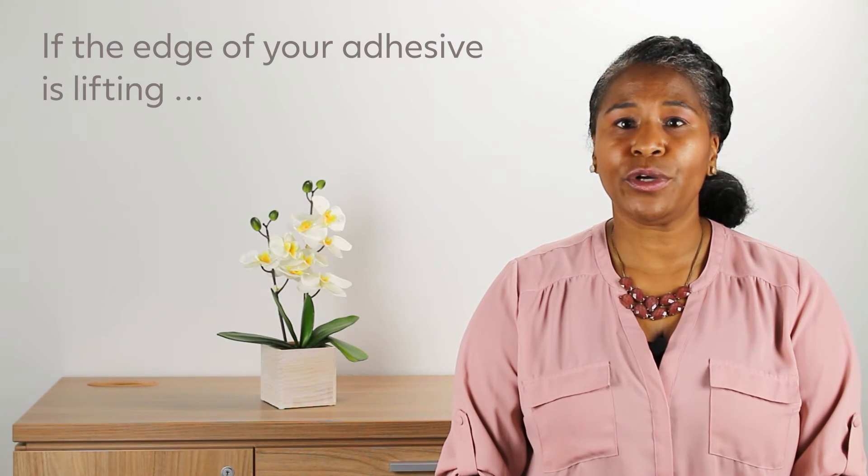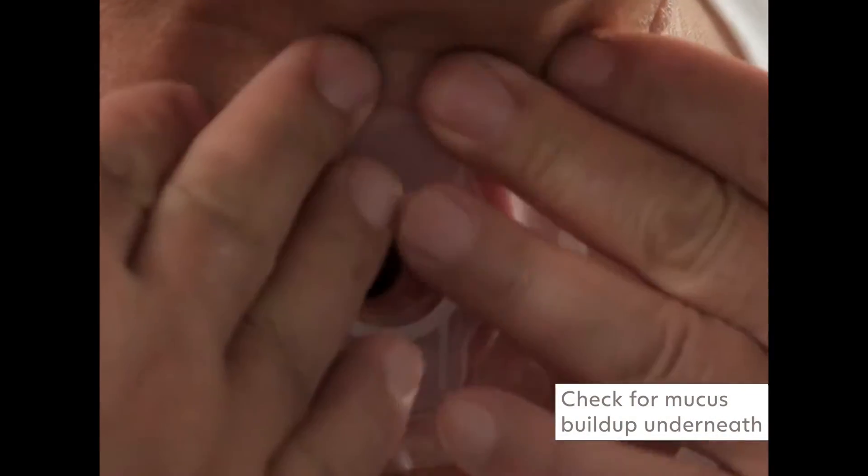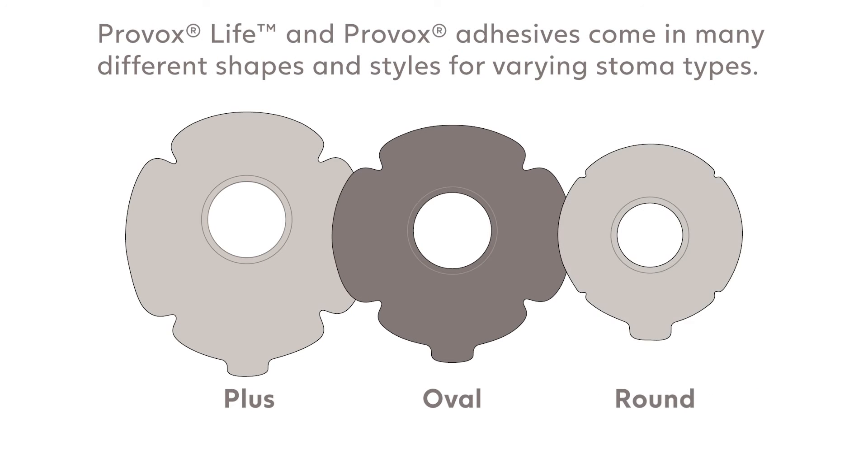If the edge of your adhesive is lifting, check to see if there is mucus building up underneath the adhesive or if it is loosening in the same location every time. Select an adhesive that best fits your stoma shape, and speak to your clinician about other adhesive baseplate troubleshooting options.